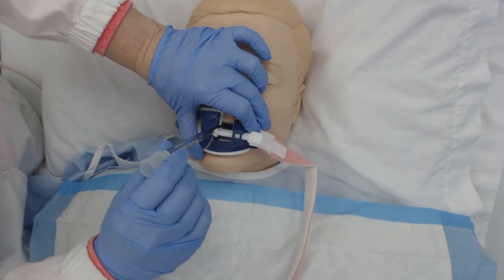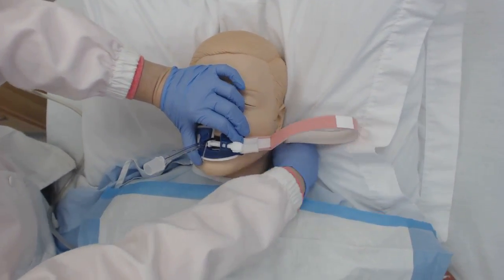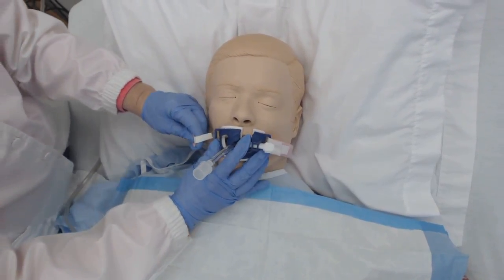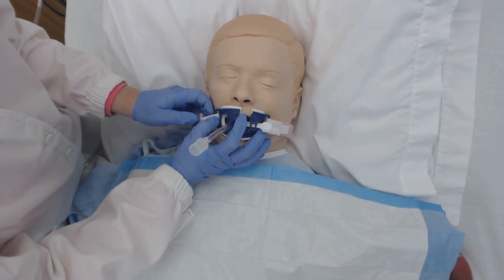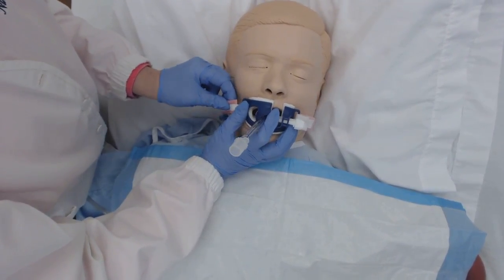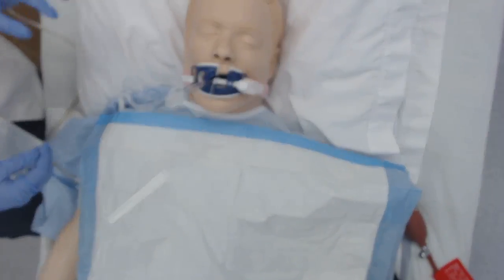I'm going to tighten this so that the ET tube stays in place — not going to occlude it, just tighten it until it stays in place. Then I'm going to feed this back through the patient's neck, down through the hair. And that is very secure.